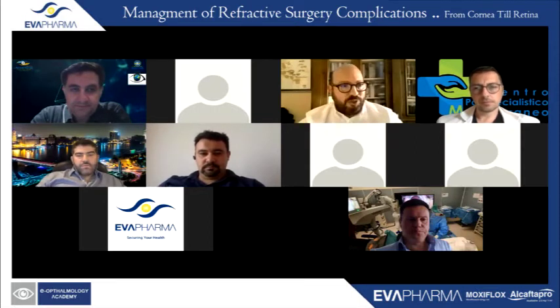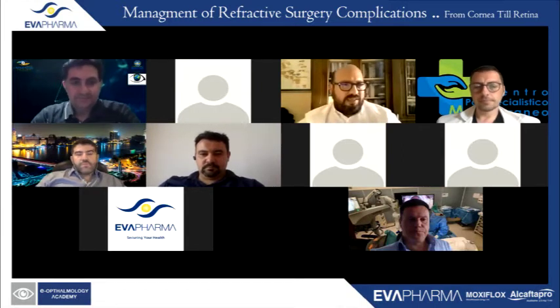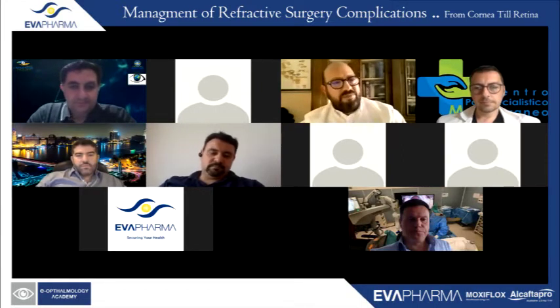It is sure. We use accelerated pulsed light nomogram with a duration of UV exposure of 10 minutes, 12 minutes, no more. It is sufficient to have a good result, to stabilize the cornea.